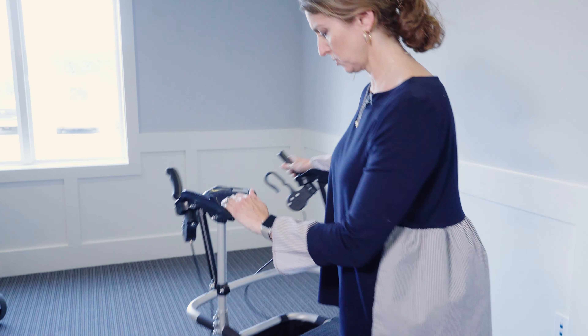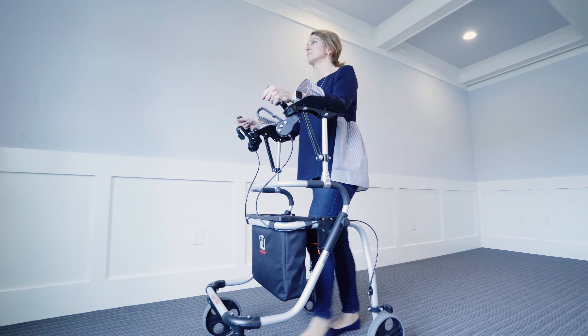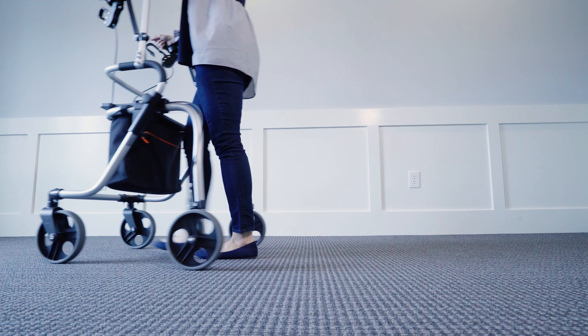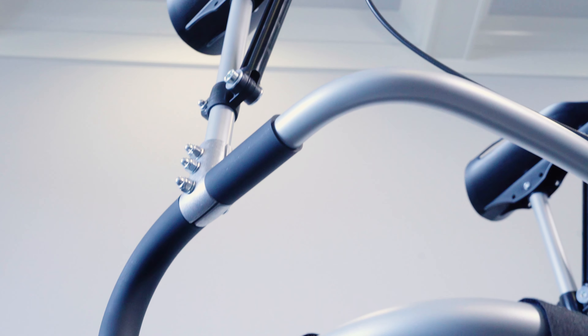The turning radius is small — you can really turn very easily and it's very easy to maneuver. Most platform walkers I've used in the past are not this fluid and smooth-rolling. One of the reasons is that it has solid wheels: all four wheels are the same size, the two front ones swivel and the back ones don't. That's why the Yano platform wheeled walker is so easy to turn and maneuver so smoothly and fluidly, and why it feels so solid.